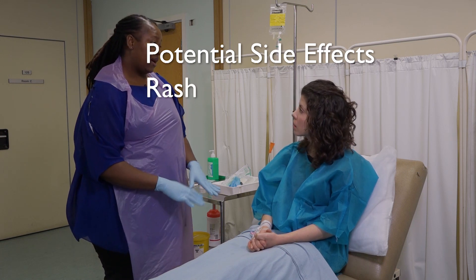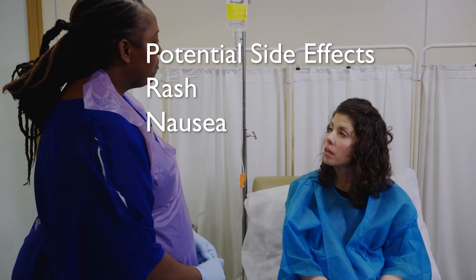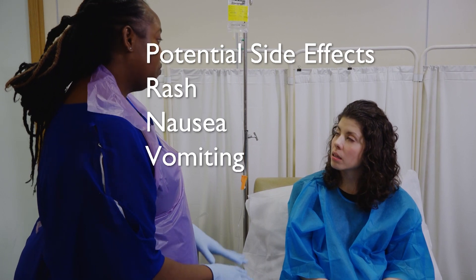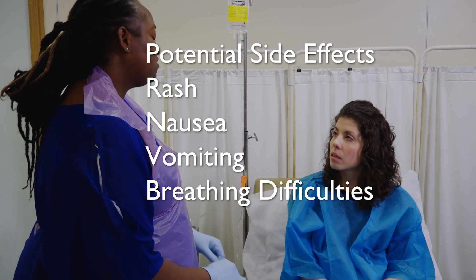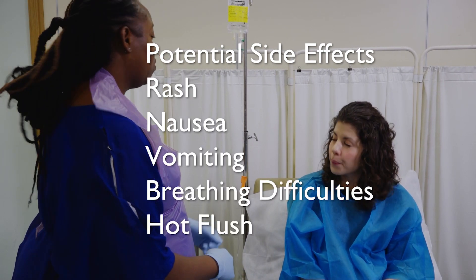Advise the patient to inform staff of any adverse reactions such as vomiting, difficulty in breathing, or a hot flush.